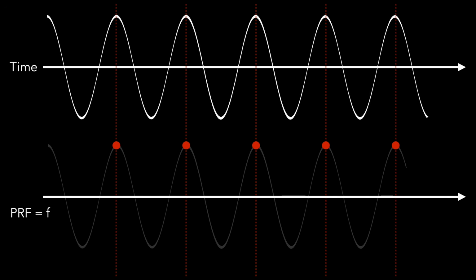You can start wherever you want, but this one's at the top of the peak. And to go one cycle, you go all the way down, and you go all the way back up, and then you're starting over again at the top of this peak. So the goal of this mind experiment is to reproduce this sine wave above on the graph below simply by finding a rate of capture where, as we travel through that sine wave, we can then reproduce it using these red dots below, right? I don't know if that makes sense, but that's kind of what we're doing.